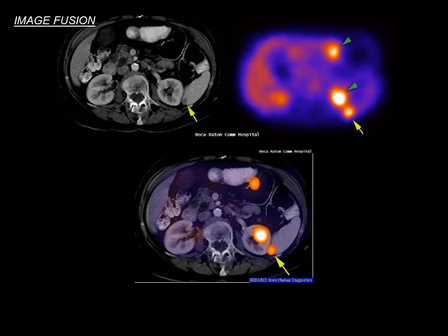This is an example of a fusion image produced by merging a PET scan with a high-resolution CT scan. The product is a fused image that provides for fine localization of tumors in the soft tissues.